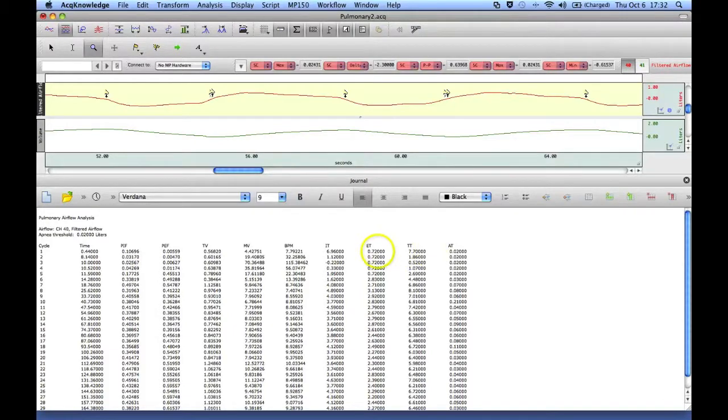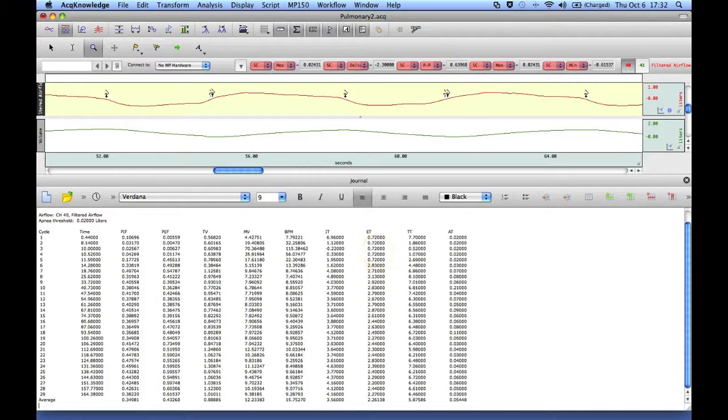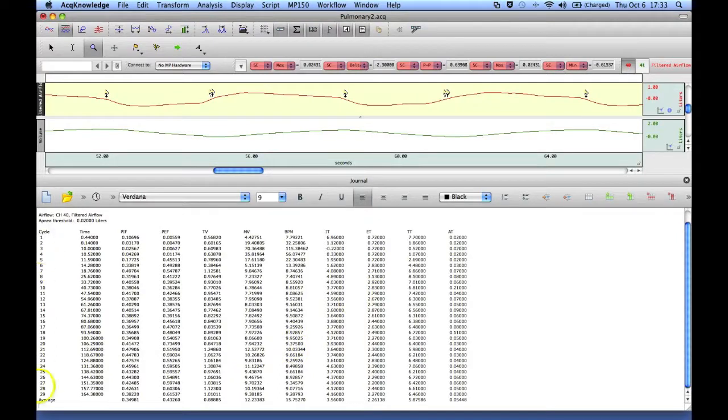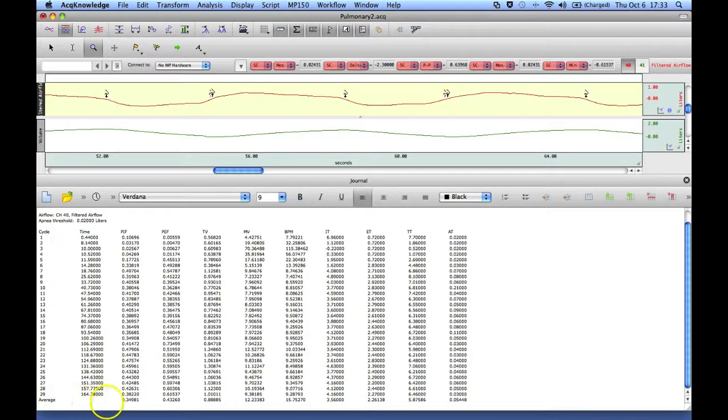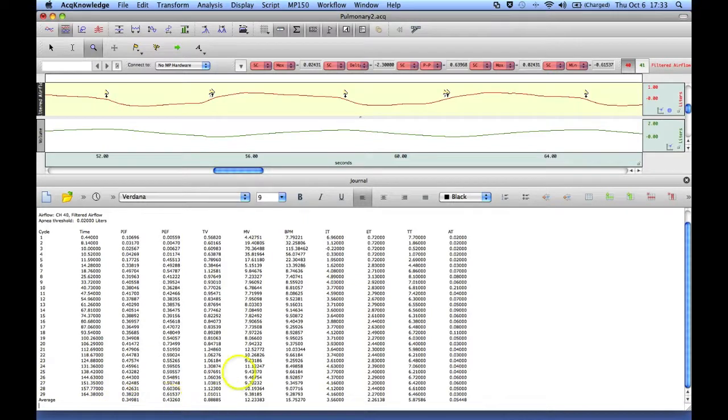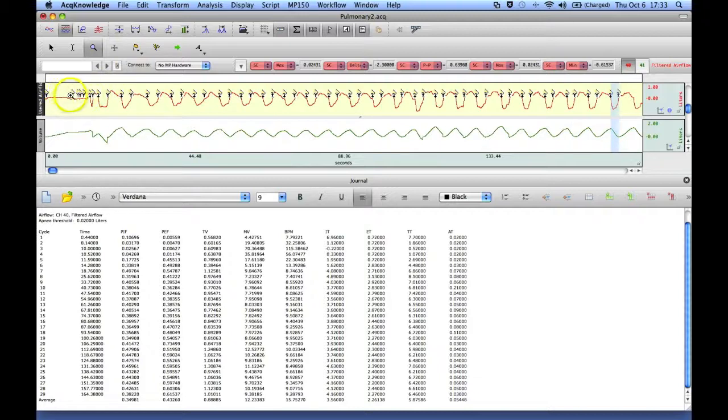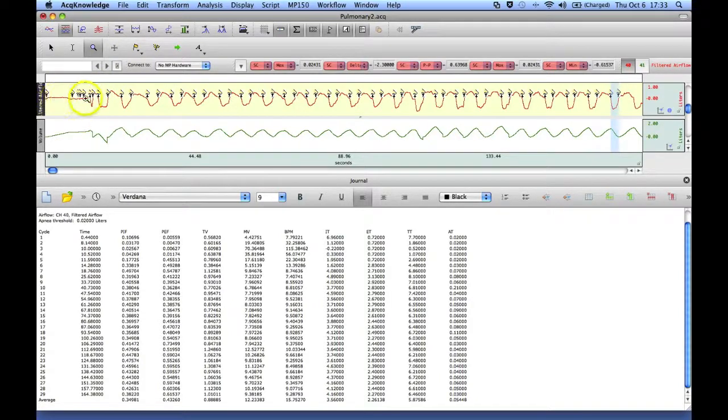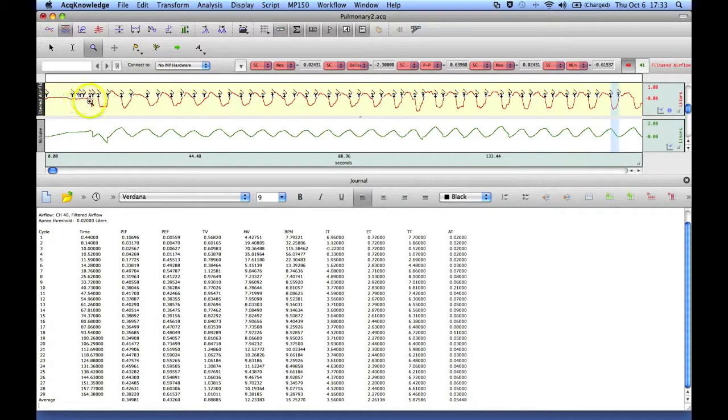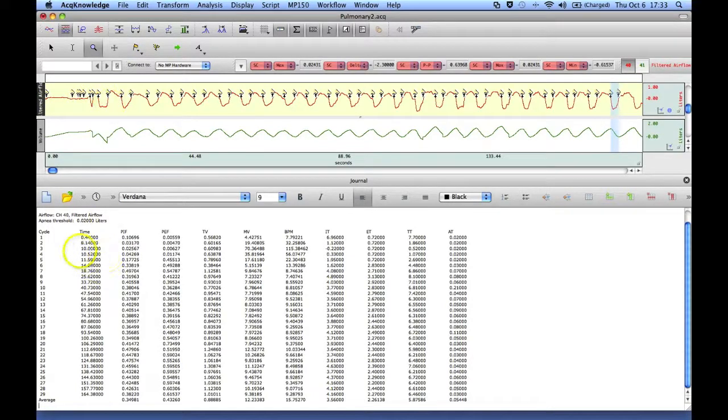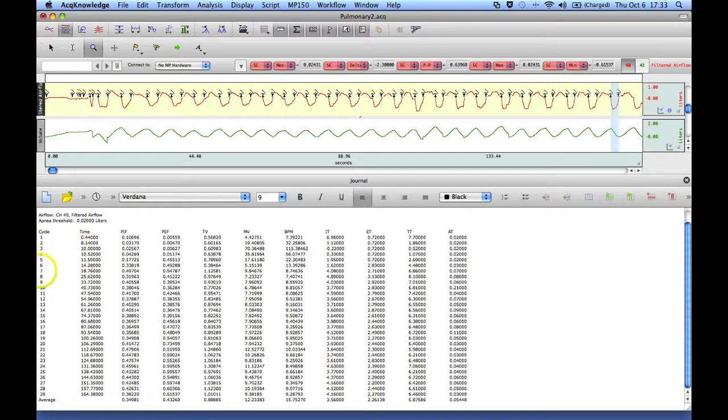And then we scroll down at the bottom, so we only had 29 cycles here. We then have the average at the end, and if we look at the data, you'll see that there's a number of cycles at the beginning where we had no data and the signal was just hovering around zero. So technically we really shouldn't start looking until we get down here somewhere.